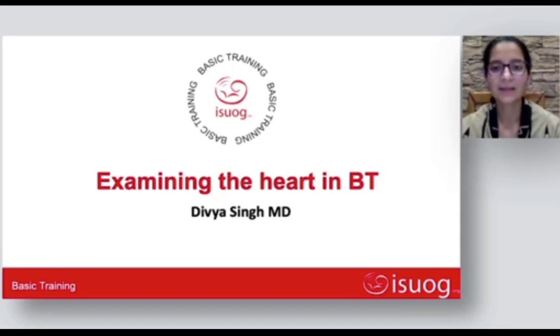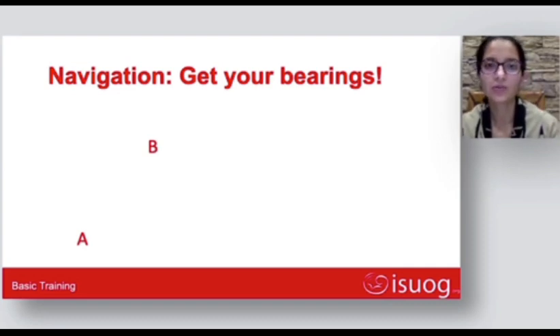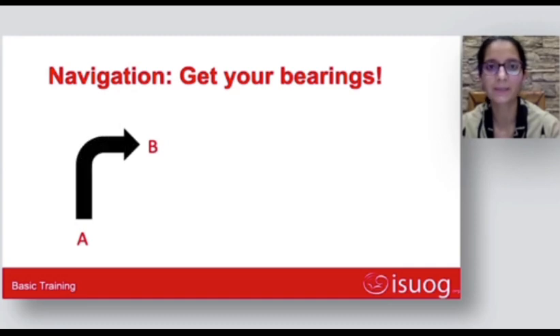Greetings of the day, everyone. Let's get started with examining the fetal heart. Now, when we have to move from one place to another, we first need to know where we are based and also where we plan to go so that we can decide the shortest possible route using our navigation system.